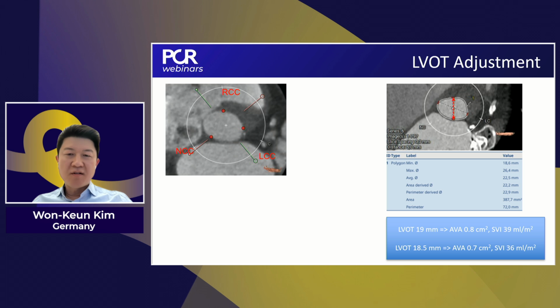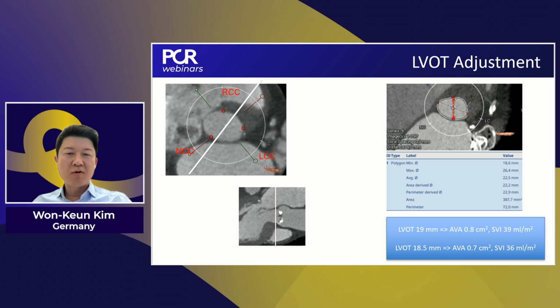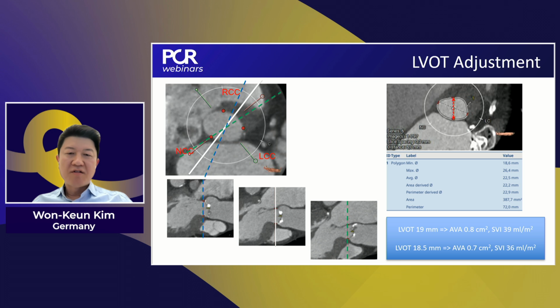I have an interesting slide, because what we measure on TTE in the long axis usually corresponds to the short axis on CT. And you recall that we measured an LVOT of 20 millimeters, and with an adjusted measurement the minimum diameter would be in the range of 18 to 19 millimeters. At least the stroke volume index would approach low stroke volume.